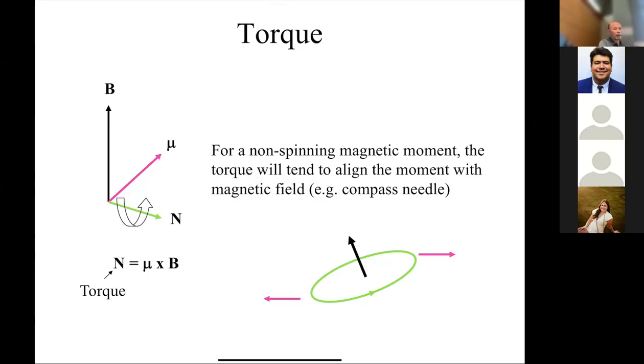And that's where I always bring this prop with me. Some of you may have seen this in a physics course before, but I do it again because it's always fun. So this is going to represent my spin. This is obviously the lowest energy state for this thing, and the highest energy state would be if I went this way, and this would be an intermediate energy state. If there's no angular momentum, then it just goes back to its lowest energy state.